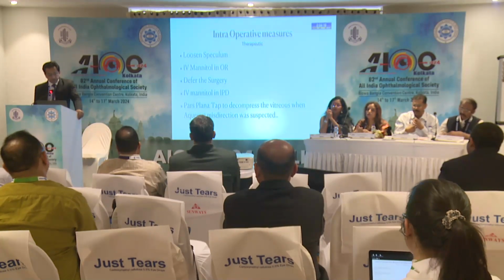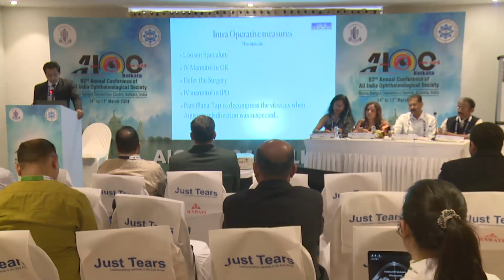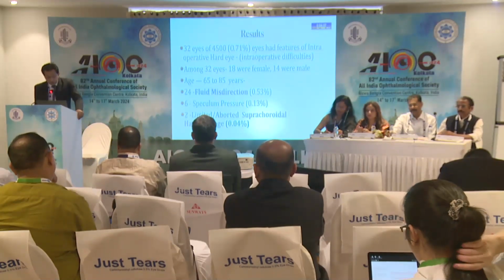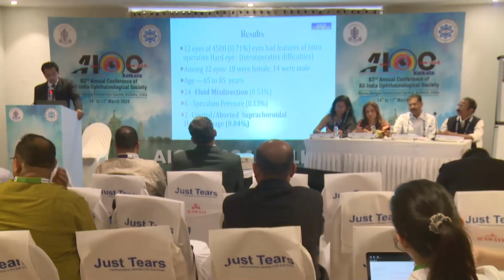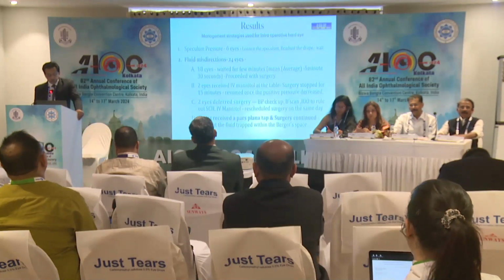The intraoperative measures we took were, apart from checking the external pressure source, defer the surgery, do IDO, B scan, IV mannitol in the OR or in the IPD, and pars plana tap when we were absolutely sure we were dealing with an aqueous misdirection. There were 32 eyes, a 0.71% incidence. Fluid misdirection was the most common cause, and 2 eyes had suprachoroidal hemorrhage, which were limited. The external source of pressure, speculum pressure, was seen minimally.